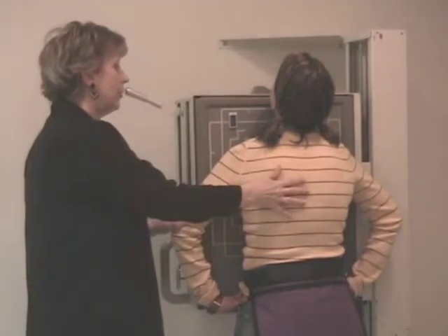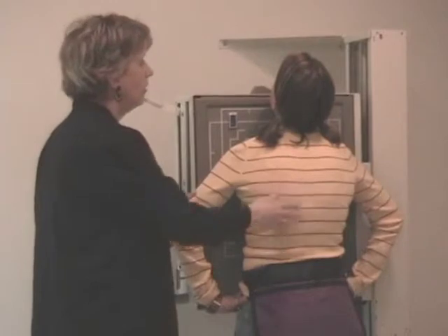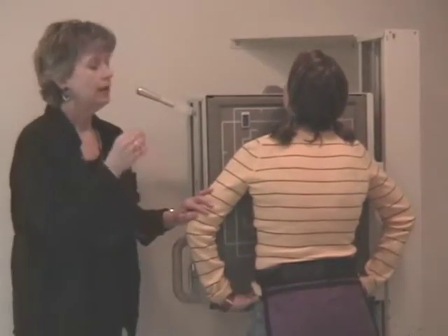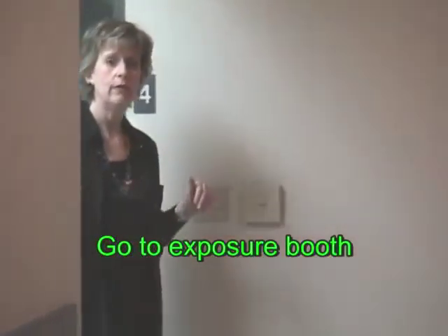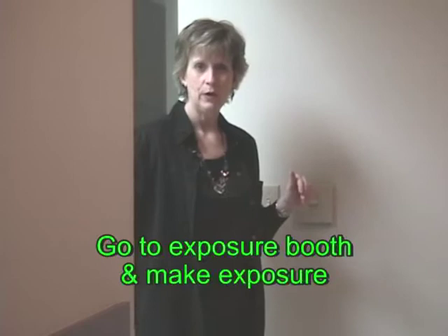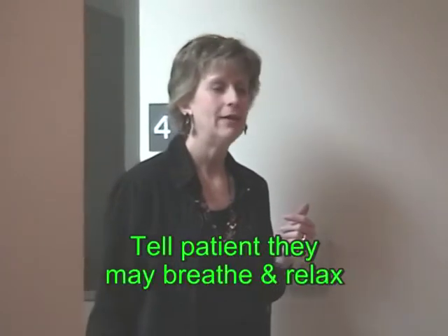I'll have you take in a breath, please. Blow it out. Take in another deep breath. Hold this one in. Keep an eye on the patient. Tell them not to move. And you go to your exposure booth outside of the room and you make your exposure. Rotor, zap. You tell your patient they may breathe and relax.